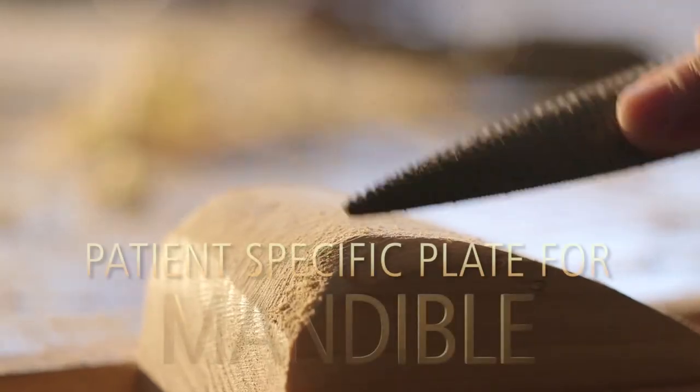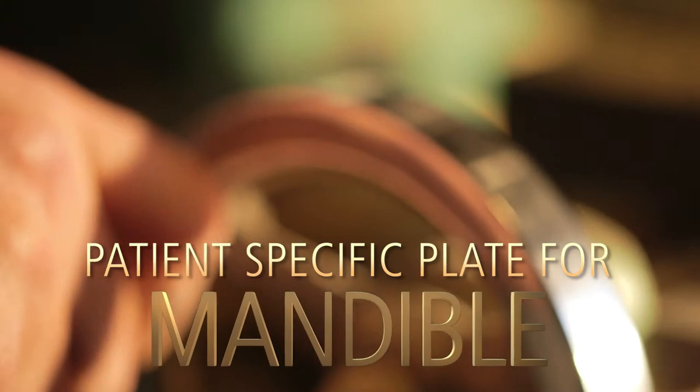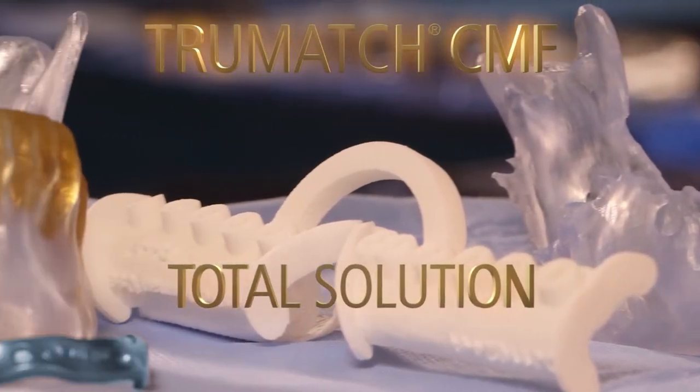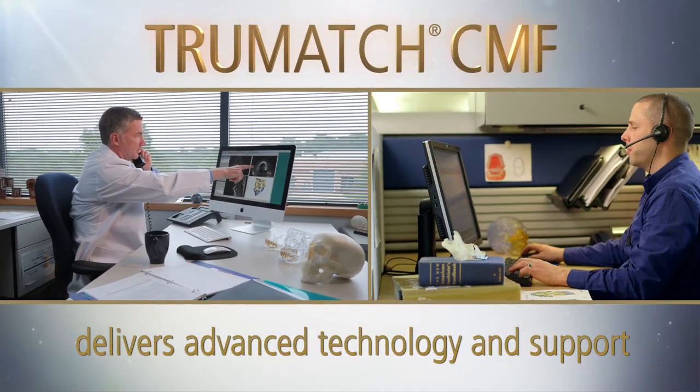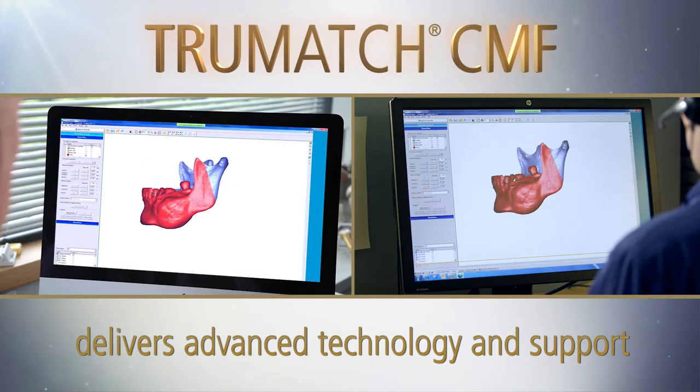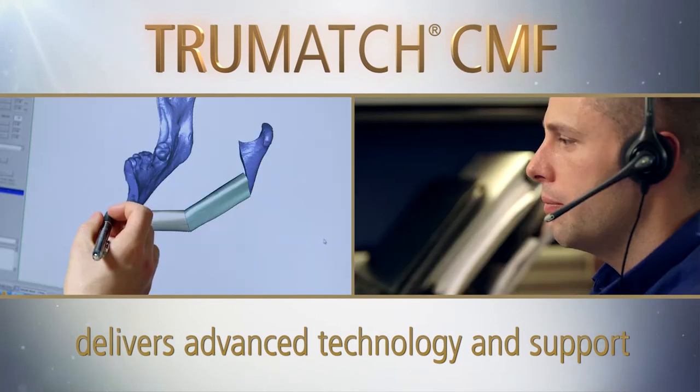The patient-specific plate for mandible completes the TrueMatch CMF Total Mandible Reconstruction Solution, built to fit each patient individually. Our seamless process matches your workflow and delivers virtual surgical planning, intraoperative patient-specific tools, and personalized implants.